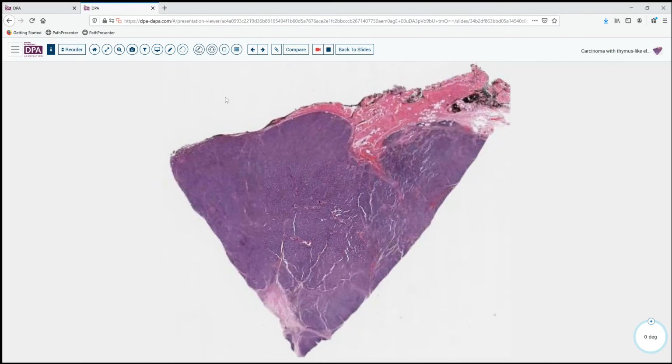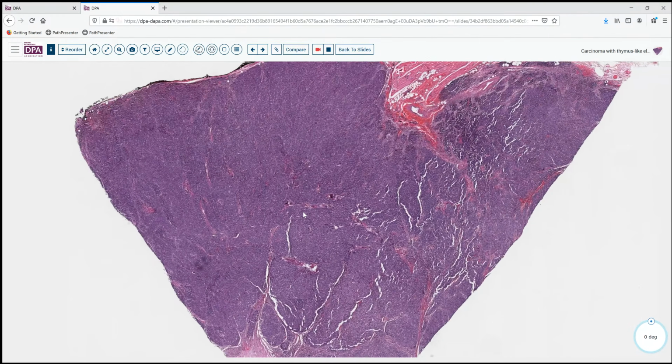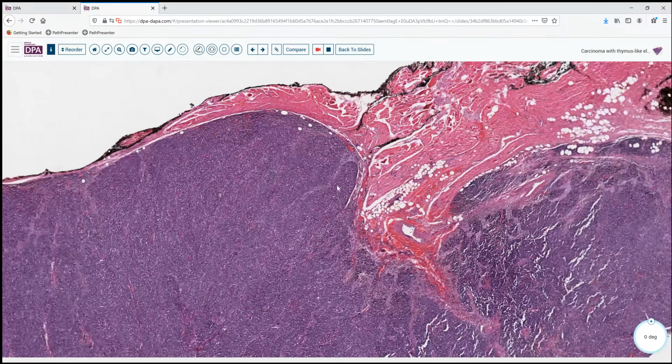So the lesion is then brought to resection, and we see that the lower pole of the thyroid has a sharply demarcated tumor, very blue, with no evident follicular structures, no glandular or other papillary type of lesions. And it's extending out into the surrounding soft tissue, nearly involving skeletal muscle here.